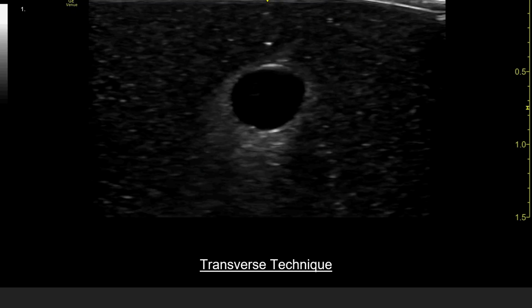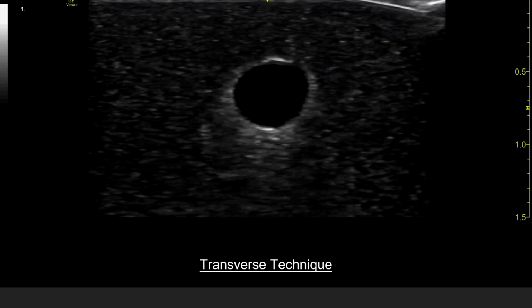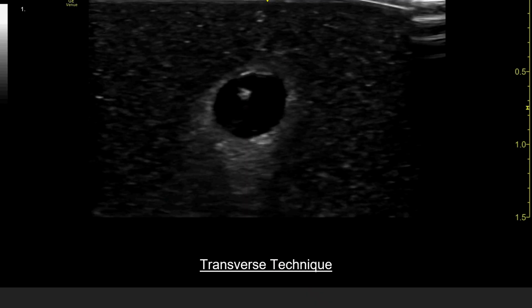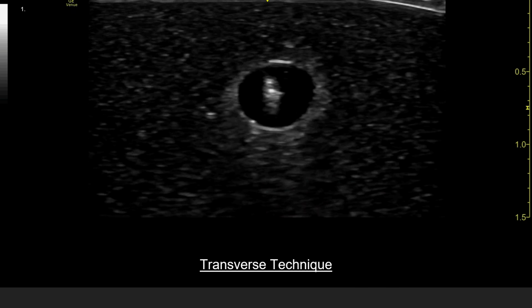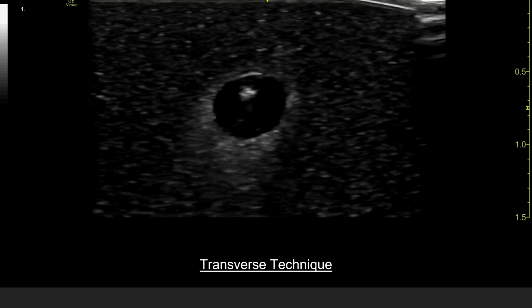So previously I mentioned whenever you get into the vessel lumen, you can actually keep watching that needle into the vessel lumen. I tend to like to do this just because of the way the ultrasound physics work. You can have false projection in that needle tip, and oftentimes you may think you're into the vessel and you go to pass that wire and everything backed out, and all of a sudden you have to start over again. You don't always have to do this, but this is kind of an insurance policy to make sure that all that hard work you just made pays off.